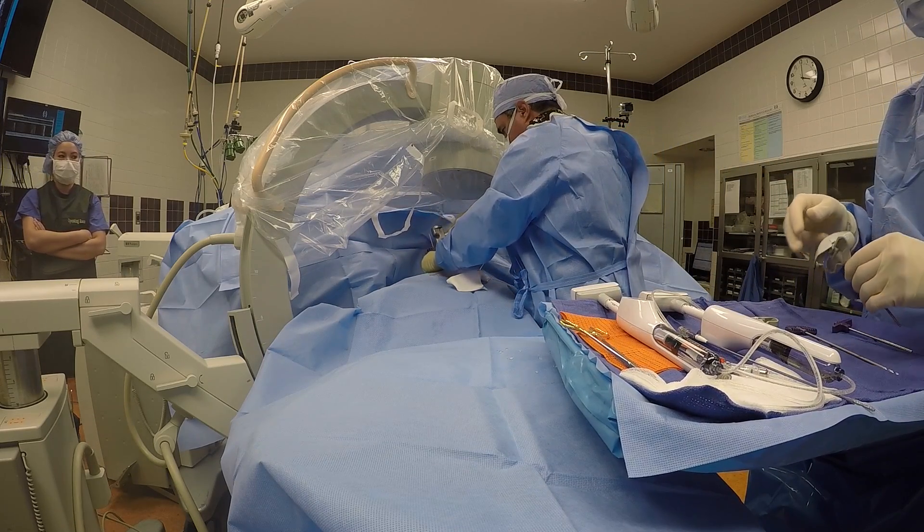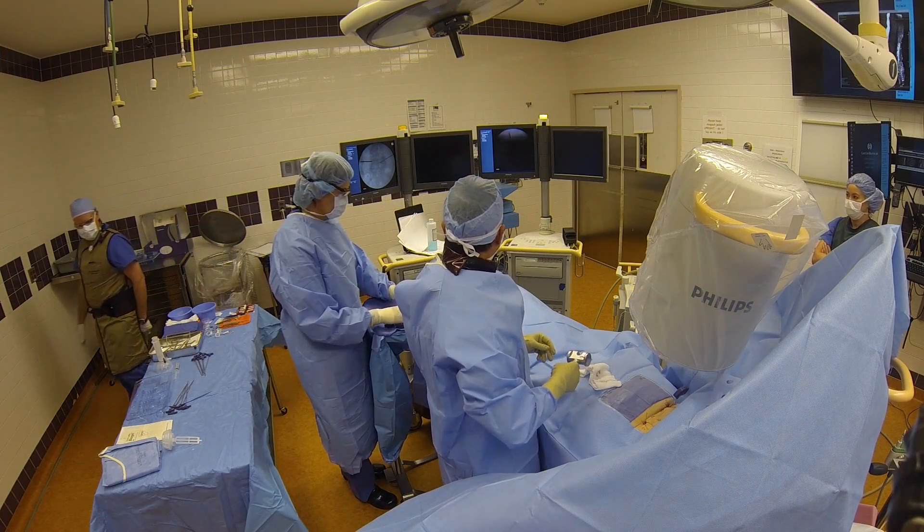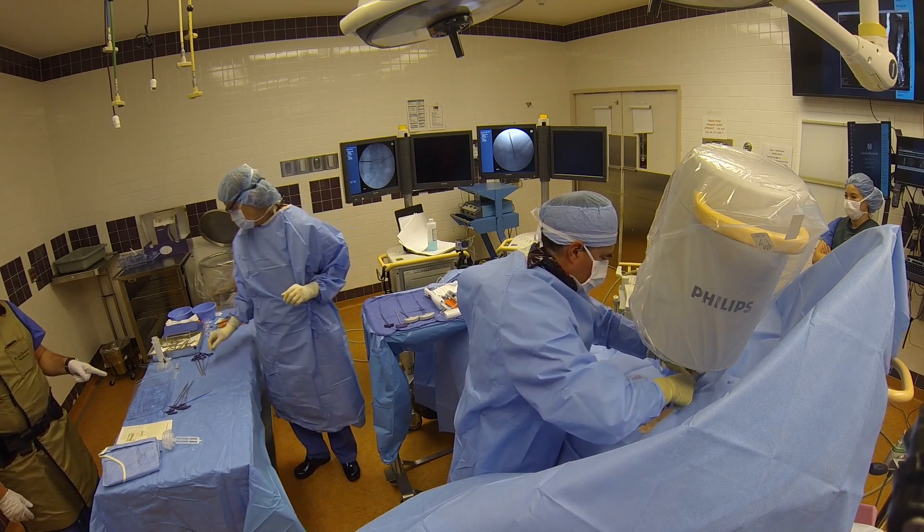If I go too far medial, I could injure the spinal cord, and if I go too far lateral, I could injure the bowels or the lungs. The x-ray in two planes allows me to do this safely.